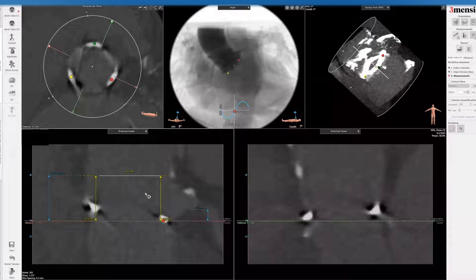You can see the risk of coronary obstruction here with the valve-in-valve. The most definitive way in my mind is actually to look at fluoroscopy — you go to the cath lab, take a picture in LAO cranial view, and do a semi-selective or pigtail shot to see how the left main clears with the valve. Sometimes with the blooming artifact, the virtual valve to coronary distance or VT-to-STJ distance looks ominous on CT, but is actually much more generous on fluoroscopy. Based on that, you can decide whether to protect the left main or use a leaflet management strategy like BASILICA to avoid coronary obstruction. CT is the standard, but I typically correlate with fluoroscopy because of its higher resolution and less blooming artifact.